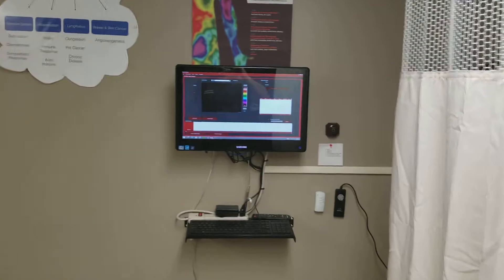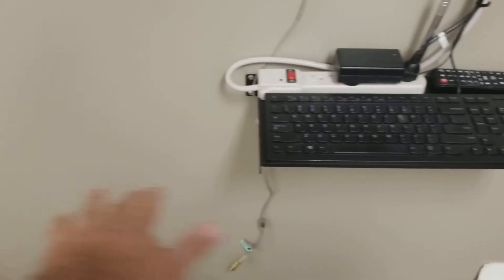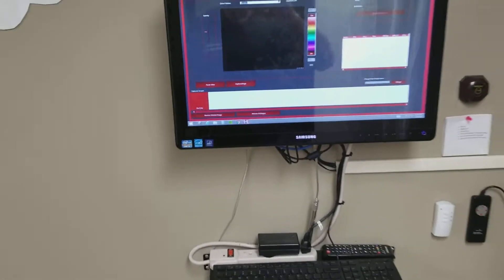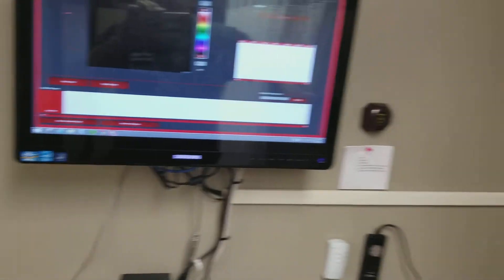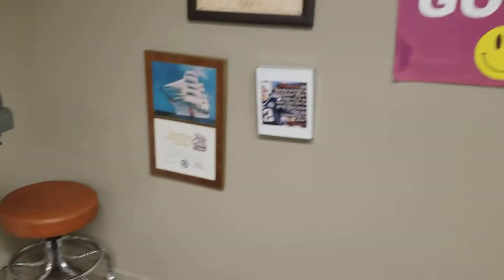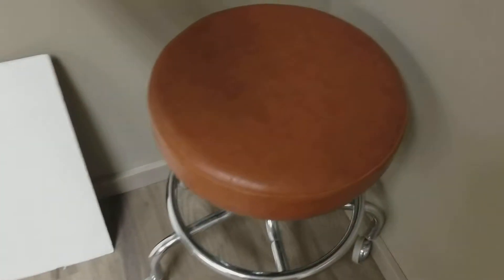We have our wall-mounted computer here, or just as well you could have a station here with a desk if you wanted to with a laptop computer. And as you can see we pull the curtain back and we have a drummer's stool — or a medical stool, however you want to look at it. We move it here for the breast screening.